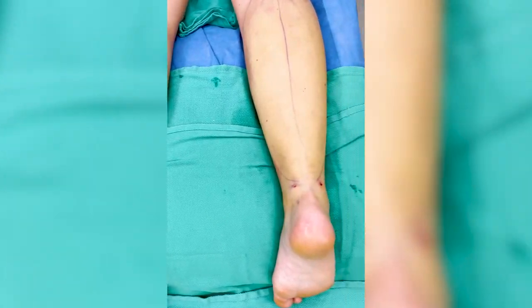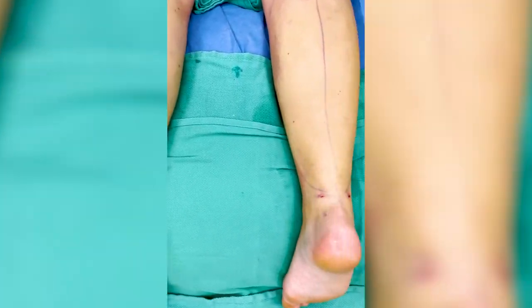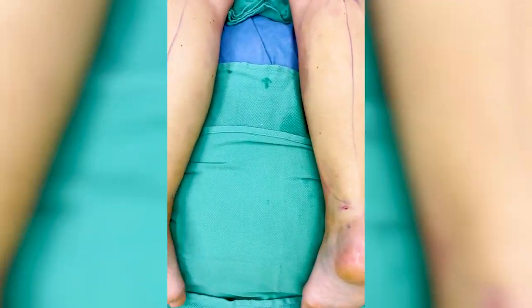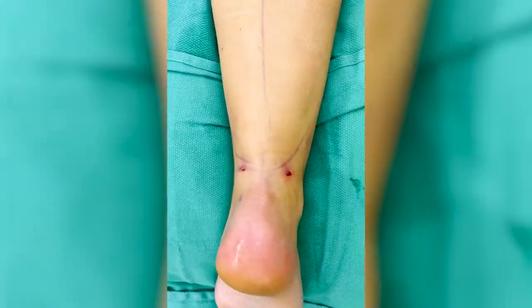We're going to stop halfway — I just want to show you the difference. Check it out. This side is done — look at that definition. This side is not done. After lipo, before lipo. What a difference. Bye-bye, cankle.